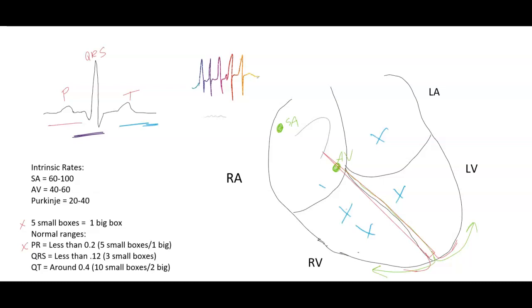After you graduate, if you do have to be on a tele floor, they will likely send you through a telemetry class. This does get way more in depth, but hopefully that helps you understand. As I tell my students, even if you don't know exactly what the rhythm is, if you can systematically start to think of, is this fast or slow, regular or irregular? Do I have P waves? Is that PR normal? Is that QRS narrow and normal? Is my T wave there? So even if you can't identify what it is, hopefully you can use terminology that may help someone else figure it out.